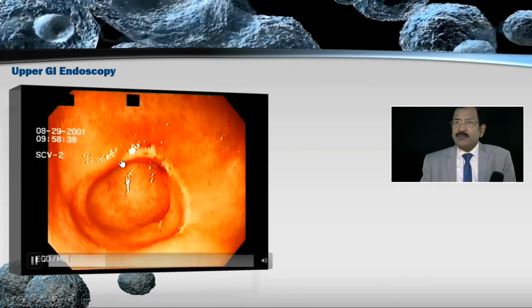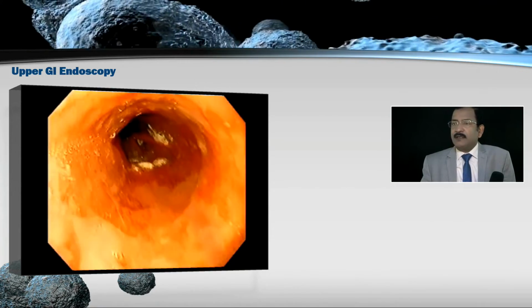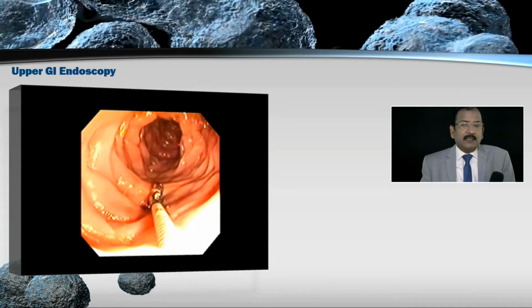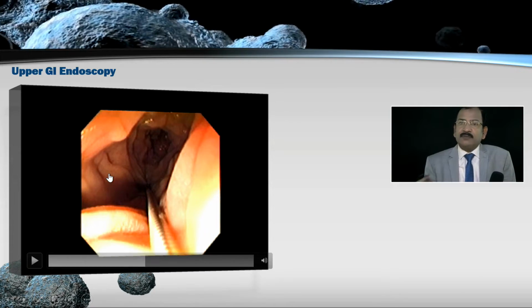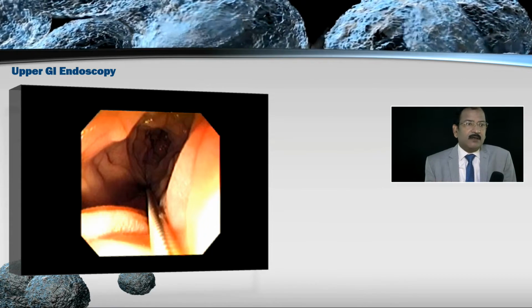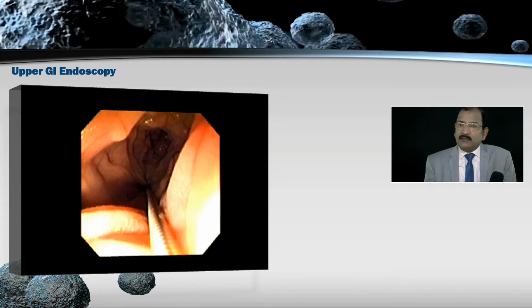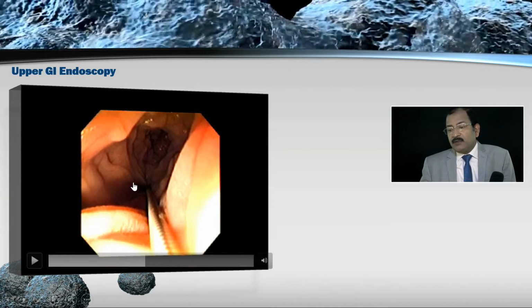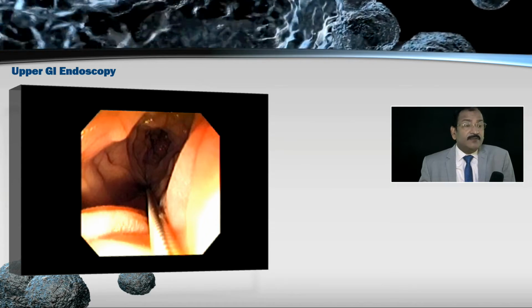Most of the time in endoscopy, we should do diagnosis at the time of coming out, not at the time of going in. We should do it at the time of coming out, because during coming out, you are relaxed. And then anywhere you can stop, you can take a biopsy, just like police when they come to search somewhere. Initially they don't do any arresting or seizing. First they come easily and they inspect everything. Just before quitting, they will do the arresting or seizing, because if they do that during entry, there will be chaos, a lot of problems, people will come, disturb, and vision will be bad.